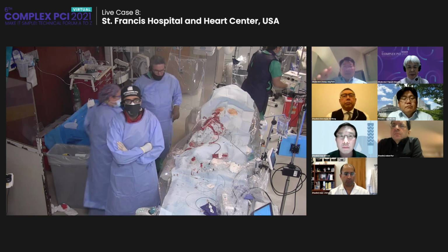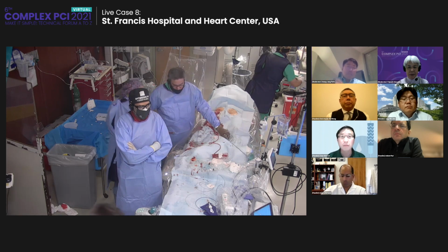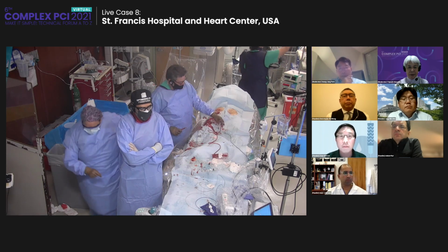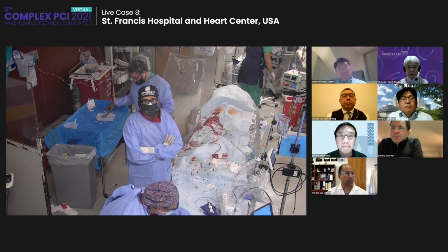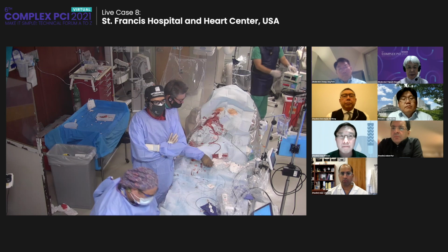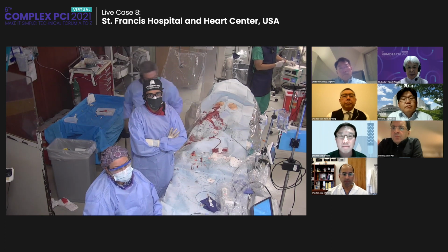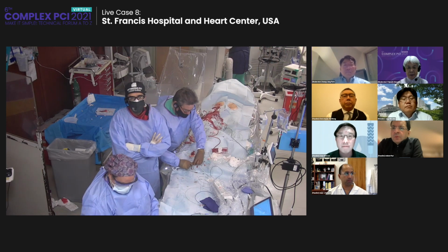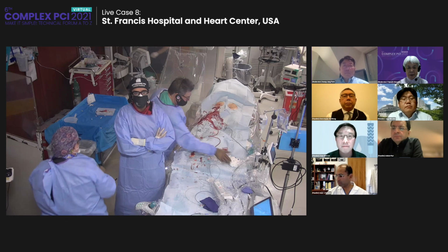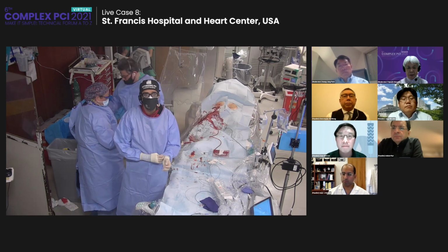Well, yeah, I think so. In fact, there are some unexpanded areas by outside calcium. I think Ajay brought this up, but the answer is yes. There is some electron microscopy data which shows that by delivering the shocks, you can damage the polymer. But given that you have an underexpanded stent, the lesser of two evils is definitely to use a shockwave and try to expand it. So it definitely does work.